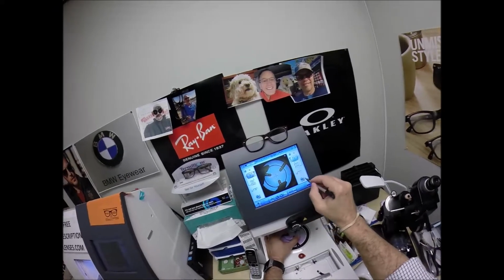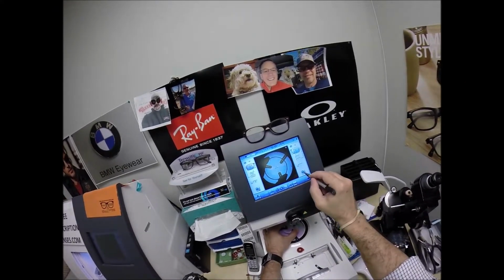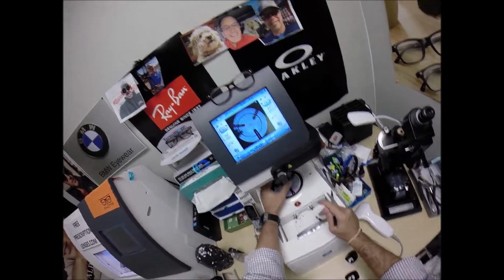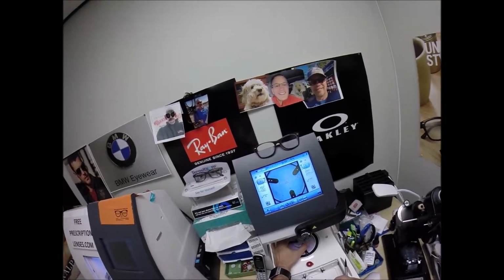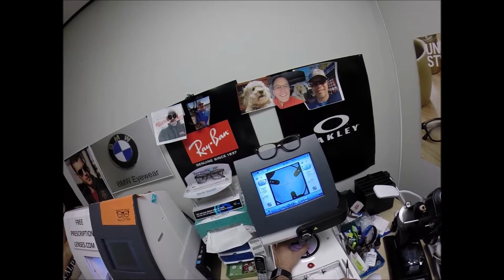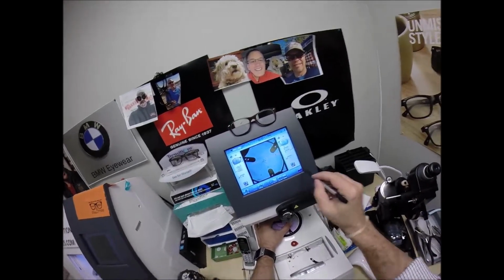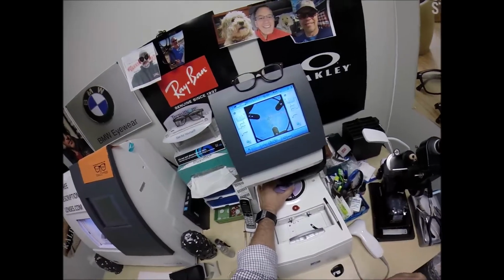Make sure the lens is large enough. That's my thumb, that's my index finger. That's my pinky. Alright, let's magnify that back again to see where we are at. Back to work, back to work. Hit that button, the arm's going to come down, place a block onto the right lens.